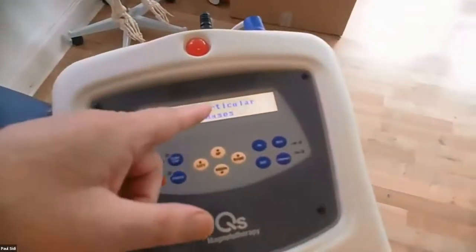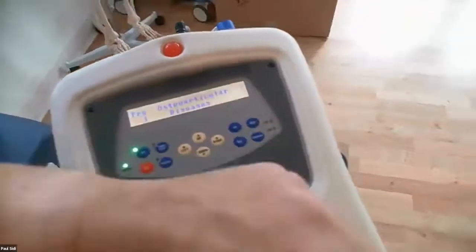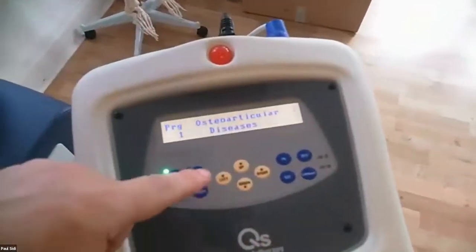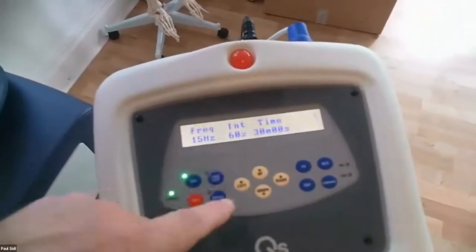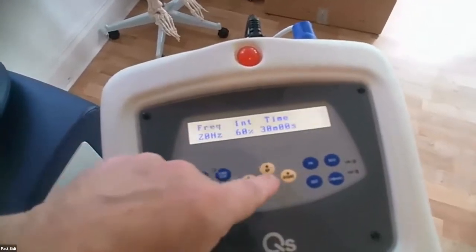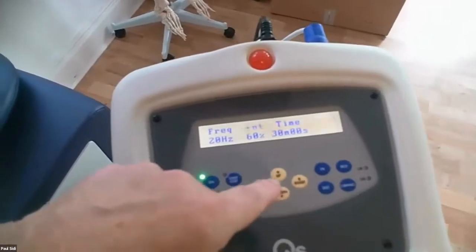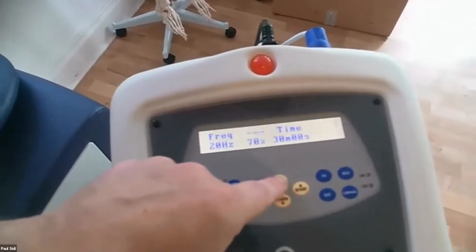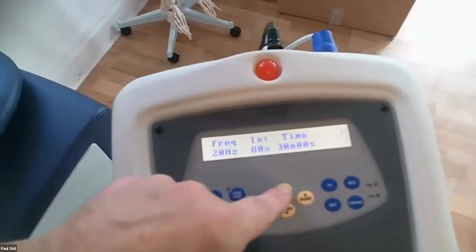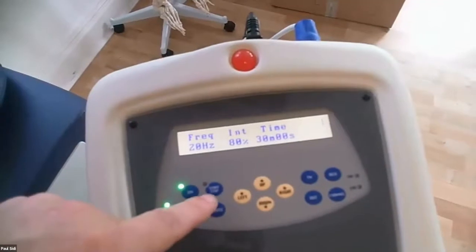I've got it on osteoarticular diseases. I'm on channel 1 for these flexi pads. All I'm going to do is press in. I'm going to probably leave the hertz at 20 hertz. Depends how chronic this is. If it's very chronic, I'm going to go a bit more intensity. She's had it a long time. I'm going to get 80%, 30 minutes, and I literally press start.